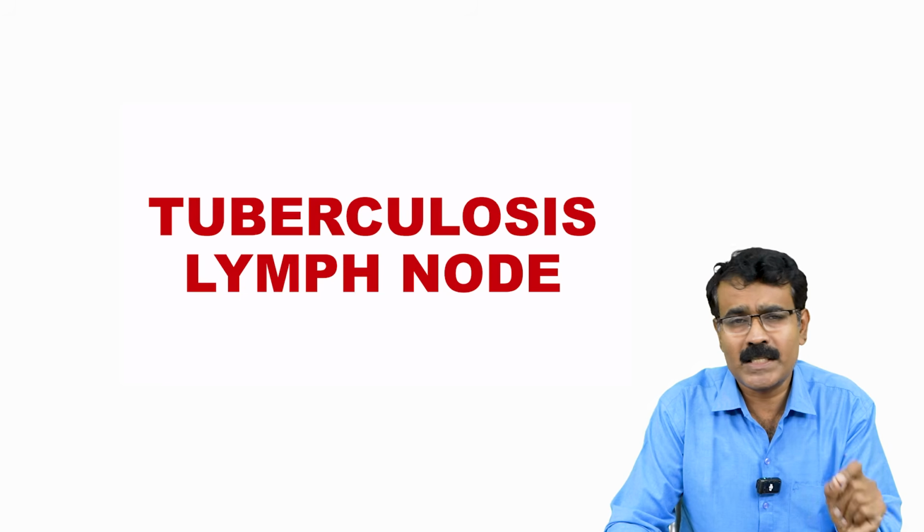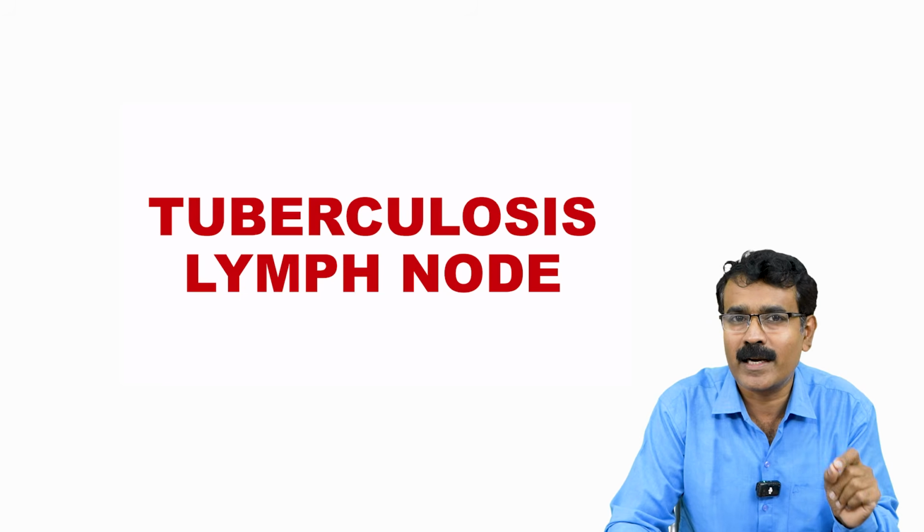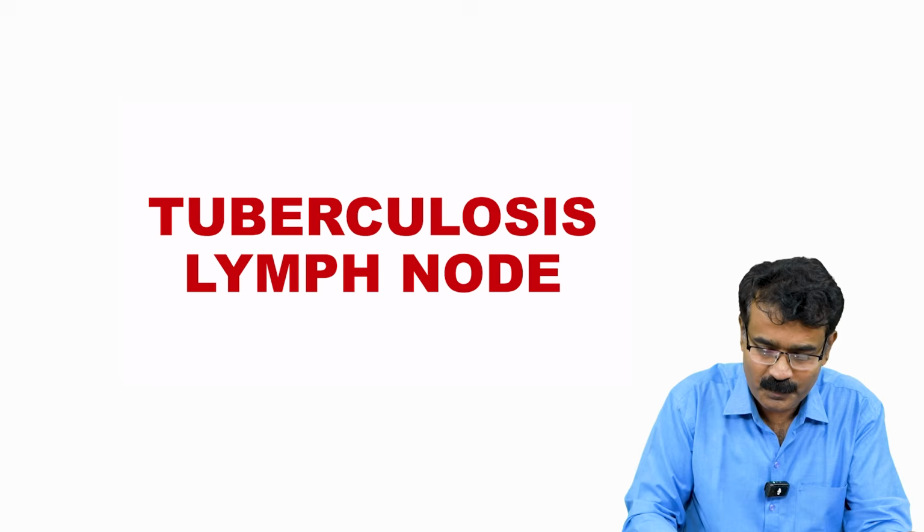Next slide which we will be discussing is tuberculosis lymph node. One of the easiest slides you can get is TB lymph node.